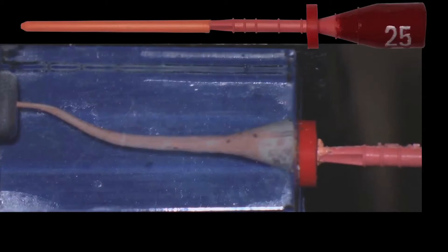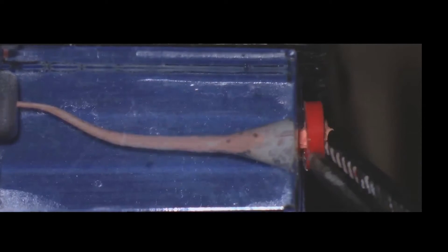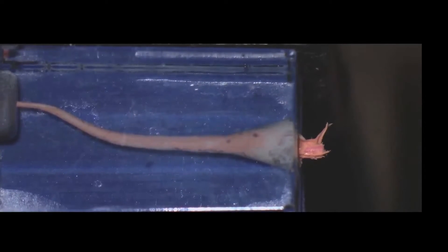WaveOne Gold will also have paper points and gutta-percha obturators, as well as size verifiers that match the taper of WaveOne Gold. After you have seen the use of WaveOne Gold on a plastic block, let me take you through a clinical case.